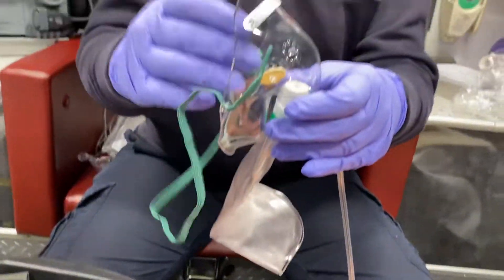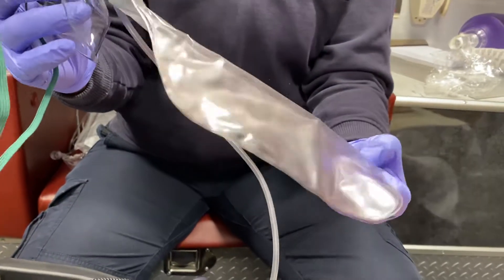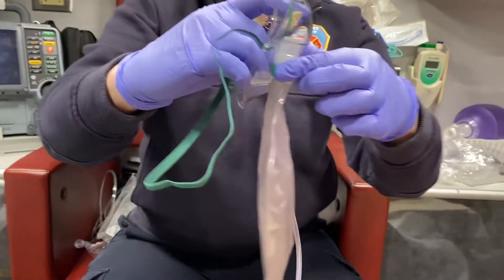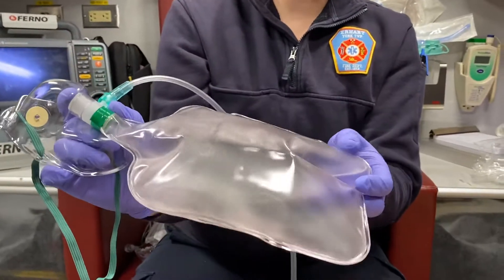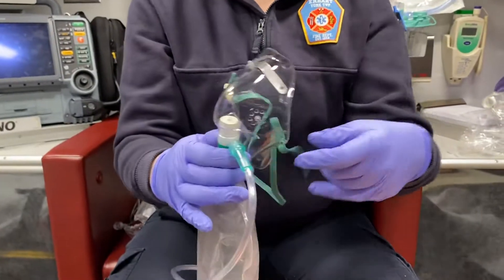Before you actually put this on your patient, you want to make sure the reservoir bag is full, because this is what they'll be inhaling — so we want to make sure they have air to inhale. A quick way to do this is to put your gloved finger over the port on the top so the bag fills faster. It must be filled before you put it on your patient.